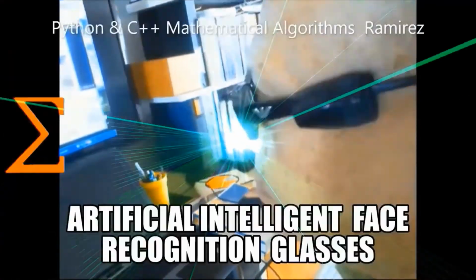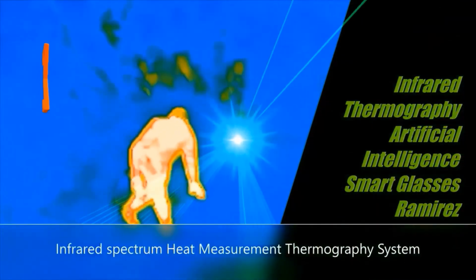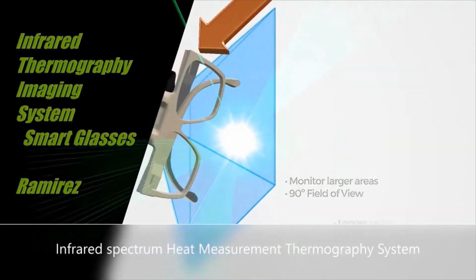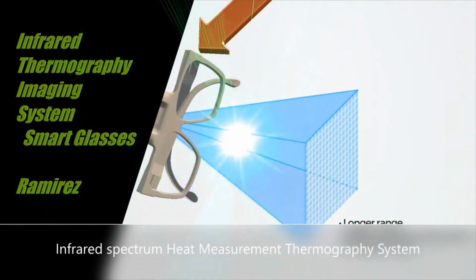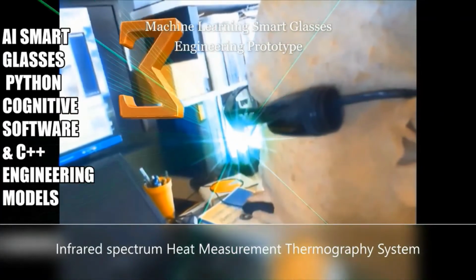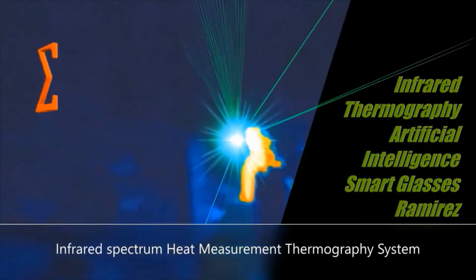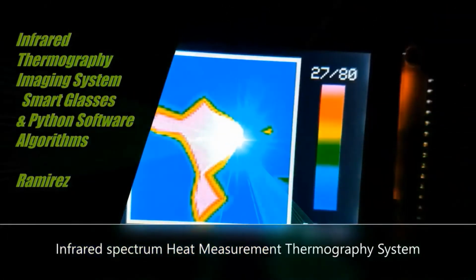The central point of the infrared thermographic imaging system used in my design is based on a focal plane array, FPA, which are integrated image sensors with sizes of 6400 up to 1,000,000 pixels.